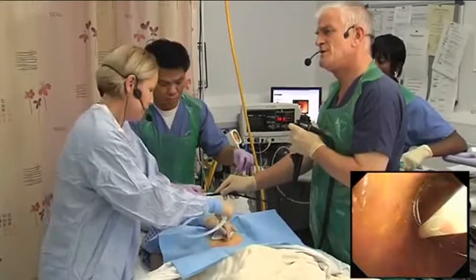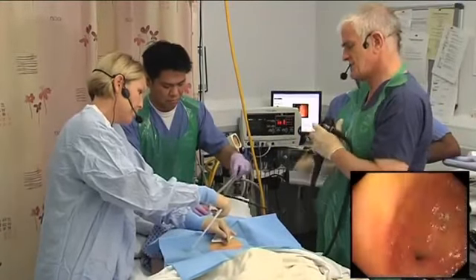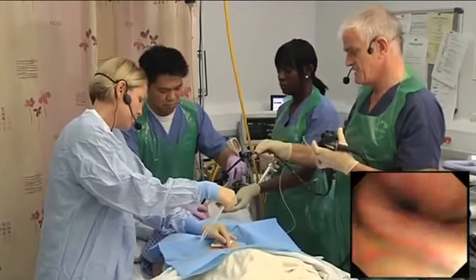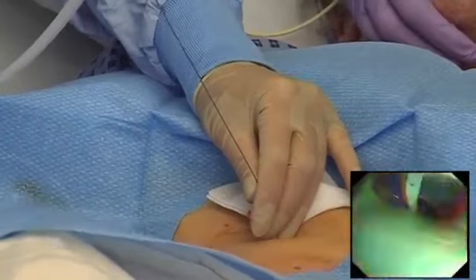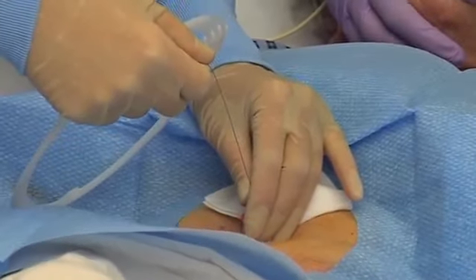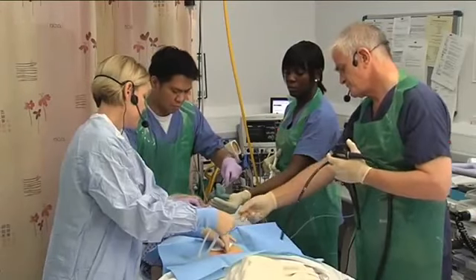Second. Open the snare. Got it. Close. I've actually grasped the wire now with the snare. I'm going to pull that back into the instrument and then withdraw the instrument. We'll pull the wire through with it. Okay. There we go. Good.